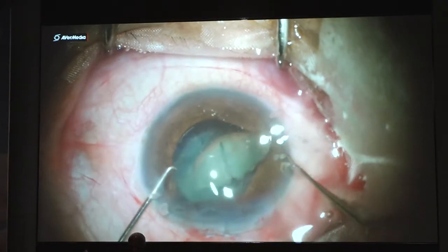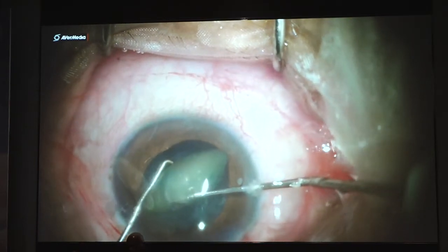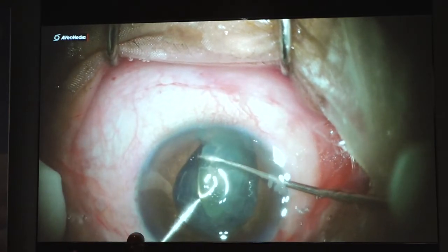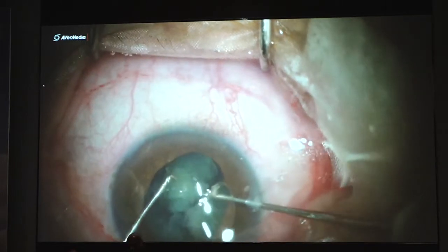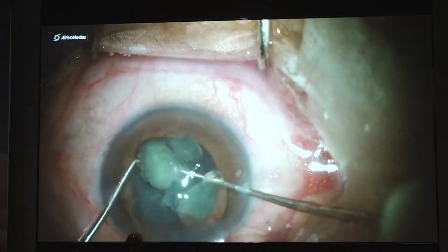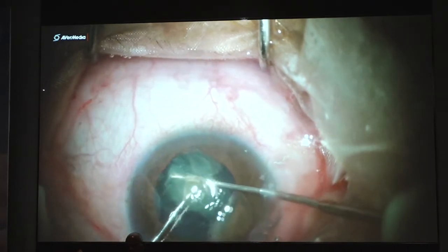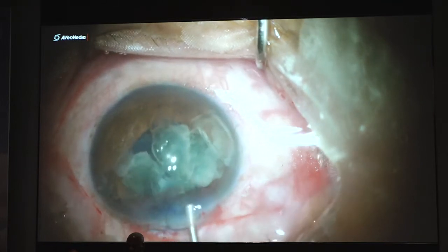Bring it into the anterior chamber, and this was the technique I was discussing, flag salute sign, and you just chop it like this. If the visco is there, there is no problem in the cornea. Cornea remains absolutely clear the next day, and these smaller pieces can then be taken out through a smaller incision. Just visco express them.